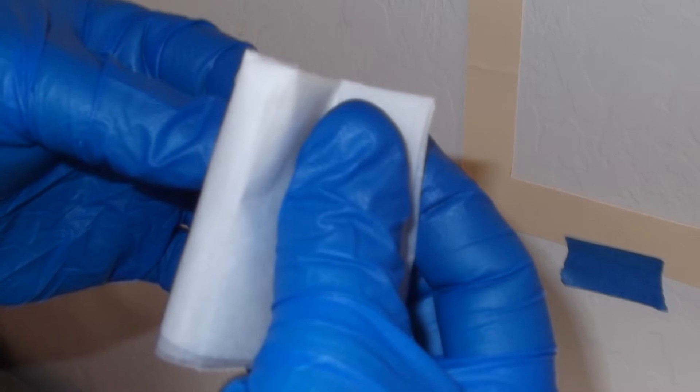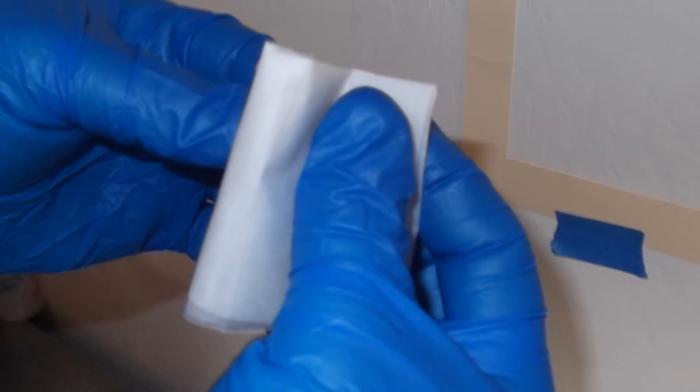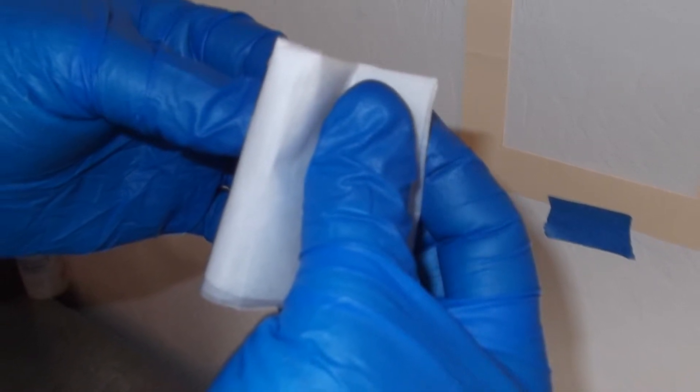Then, without allowing the wipe to touch any other surface, reverse the last fold so that the exposed side is now facing inward.